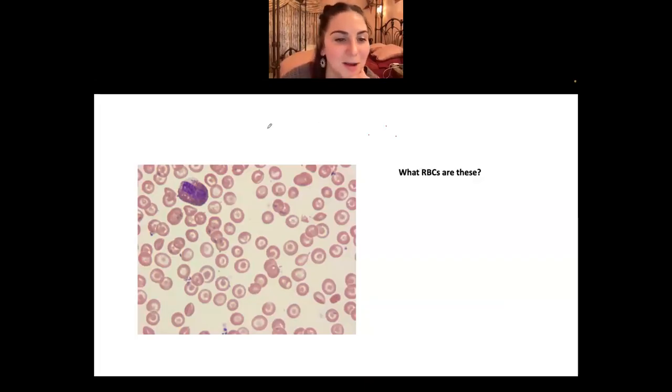Yeah, no, I'm sorry. I didn't give you guys options. I realized I probably should have. And yeah, platelets do kind of look like spherocytes, right? They're really tiny, even smaller than spherocytes. They're literally just pieces of a cell, pieces of cell cytoplasm that broke off. Spherocytes are going to be probably that big, so a little bit bigger.